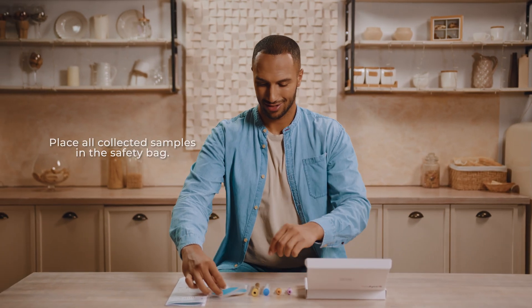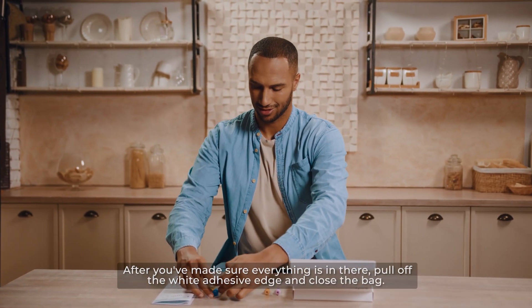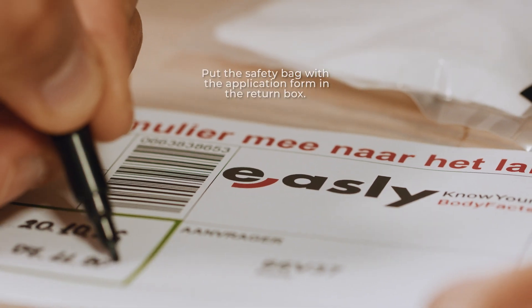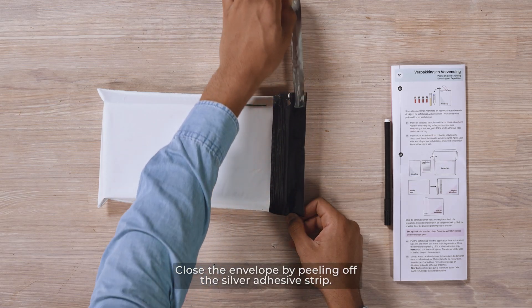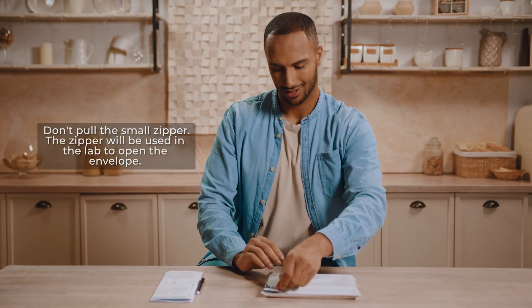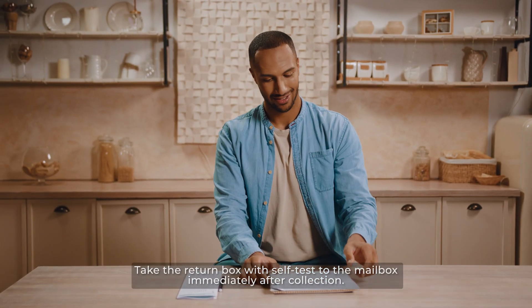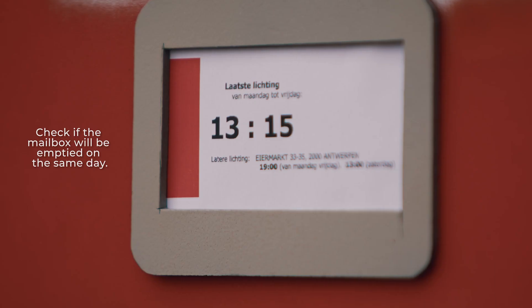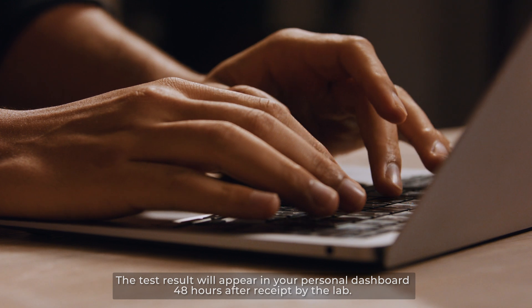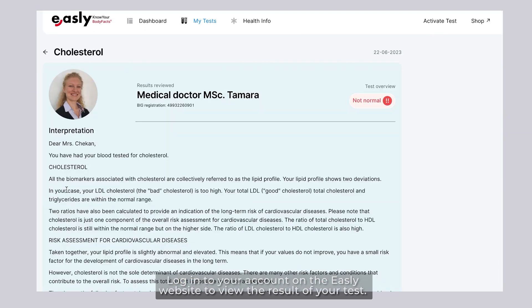Packaging and shipping. Place all collected samples in the safety bag. After you've made sure everything is in there, pull off the white adhesive edge and close the bag. Put the safety bag with the application form in the return box, then put the return box in the shipping envelope. Close the envelope by peeling off the silver adhesive strip. Don't pull the small zipper — it will be used in the lab to open the envelope. Take the return box with the self-test to a Post-NL or B-Post mailbox immediately after collection. Check if the mailbox will be emptied on the same day. The test result will appear in your personal dashboard 48 hours after receipt by the lab. Log in to your account on the Easly website to view the result of your test.